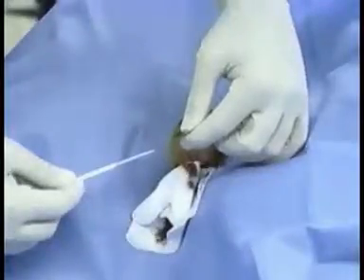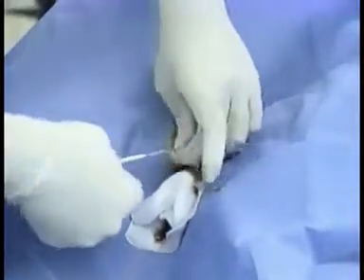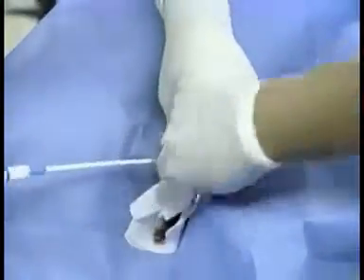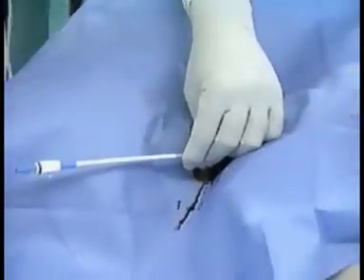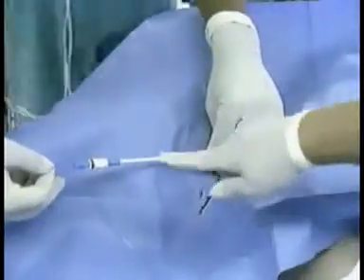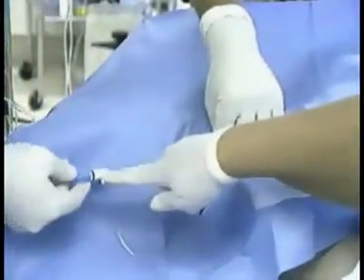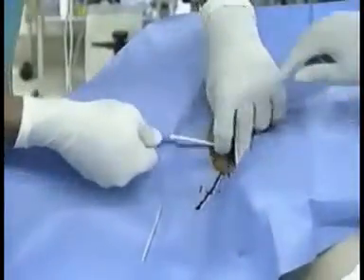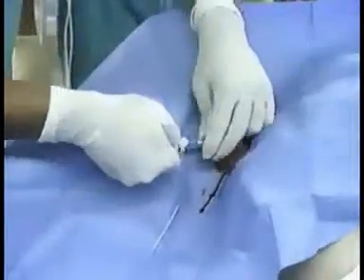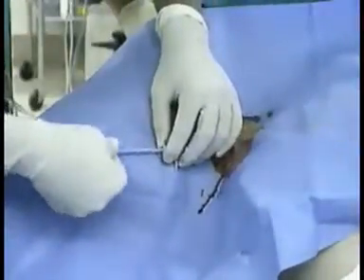Thread the wire through the lumen of the dilator and advance the dilator and introducer together over the wire. Note that the operator never loses sight of the guide wire. The dilator is advanced with a slight twisting motion, and once in place, the dilator and guide wire are removed, leaving the introducer sheath as the only connection to the intravascular space.